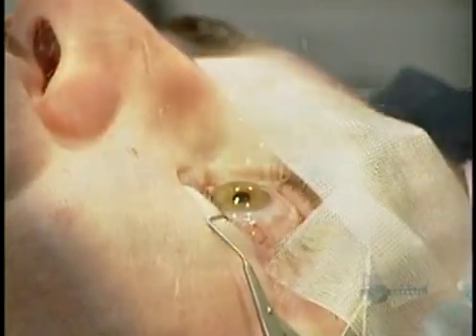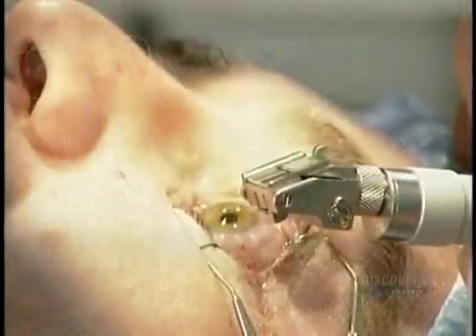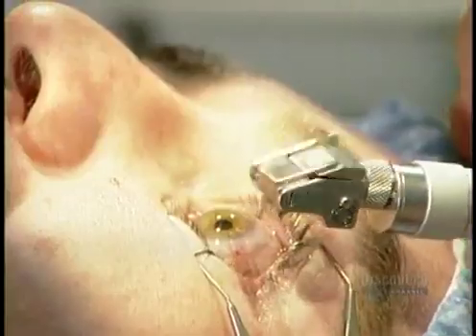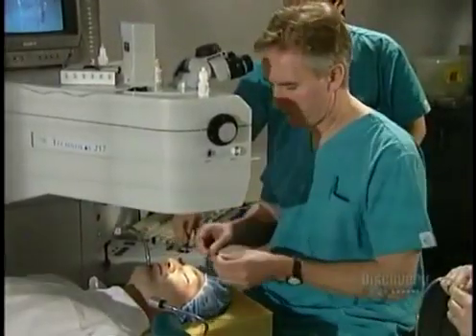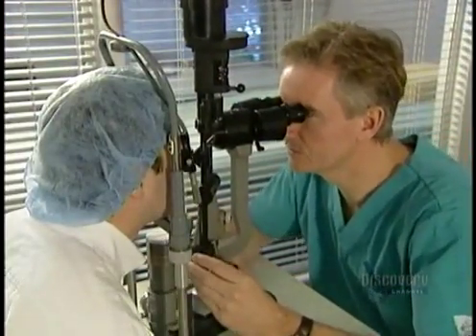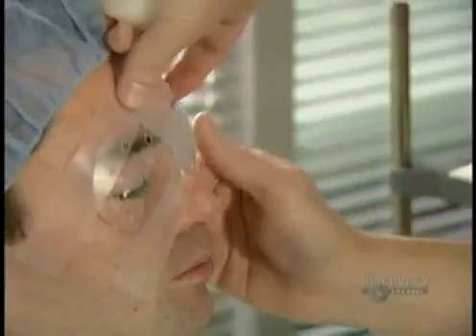With the sponge, the surgeon dabs up any excess water. He applies antibiotic drops as a preventive measure, then inspects the microkeratome again before moving on to the other eye. He takes the speculum off, tapes the eye closed, then performs the same operation on the other eye. When that's done, the surgeon uses a high-powered microscope to make sure the flaps are wrinkle-free. The patient wears protection shields until the next morning, then overnight for a week.